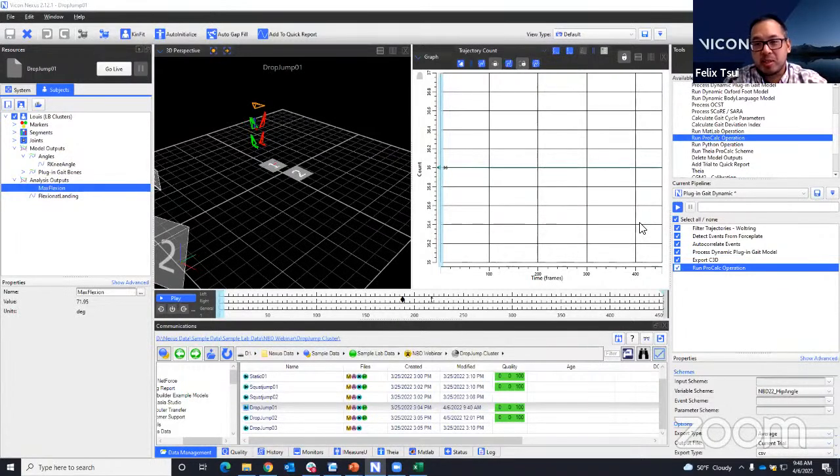And you just answered this question, but it's probably worth reiterating. What about kinetics? Kinetics is coming soon. In ProCalc 1.6, we're adding it. As is right now, we can get center of pressure data out of the force plates, and we can even get force vectors, but in ProCalc 1.5 there's no way to actually get kinetics. Like I said, coming soon in 1.6, all those capabilities will be added so we can get joint forces and moments and powers and all that good stuff.